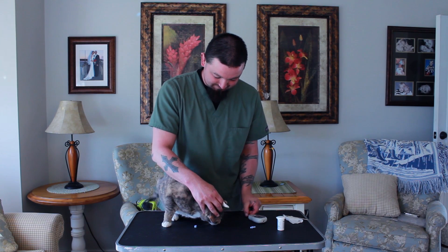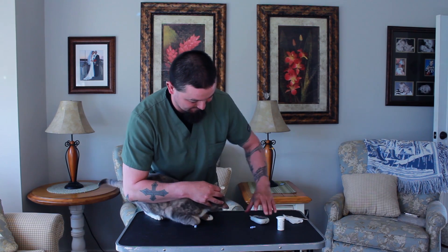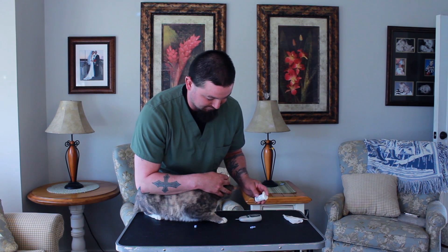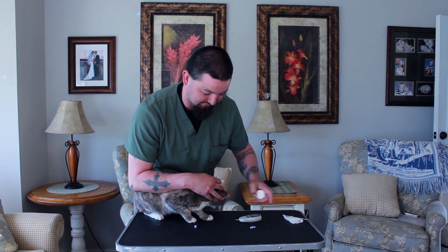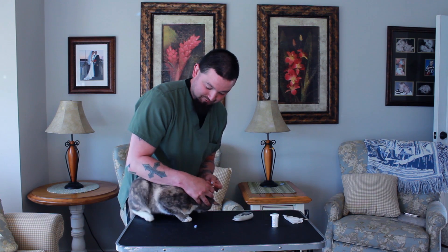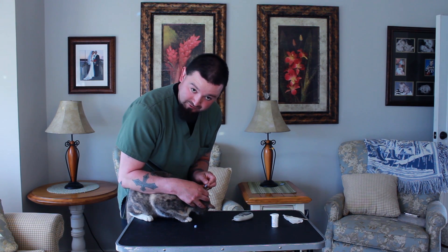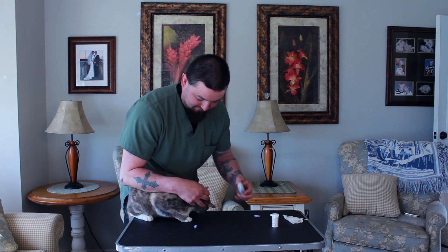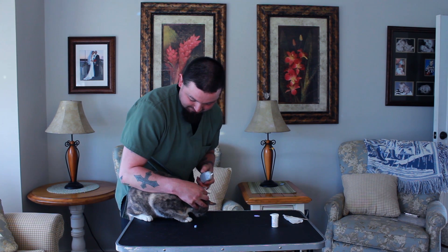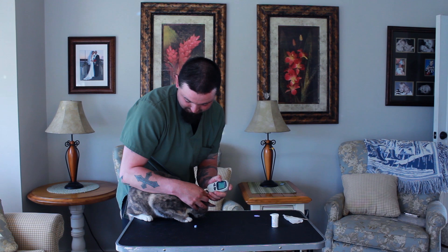Then I'm going to insert my strip and as it turns on I'm going to make sure the numbers are specific towards my cat or dog. Cats are 38 on this one, so I'm going to adjust it to 38. Now it's asking me for my sample. I'm going to poke inward and twist up a little on the way out. The Vaseline is going to let the blood sit on the very top of the ear and I'm able to apply and get my sample.